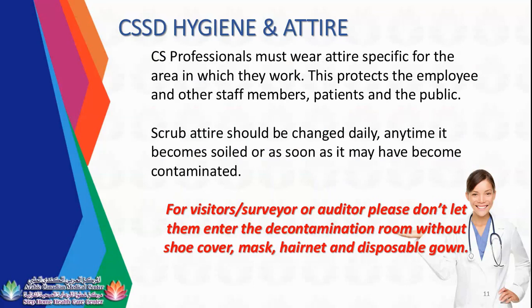For a visitor, surveyor, or auditor, please don't let them enter the decontamination room without shoe cover, mask, hairnet, and disposable gown. That's the protocol, guys. If you are letting someone enter the CSSD room and they don't have the scrub suit intended for CSSD, then they need to wear the disposable gown, shoe cover if they don't have the intended shoes, mask, and hairnet. Hairnet is very important because any strands of hair that come in contact with instruments will be considered contamination.